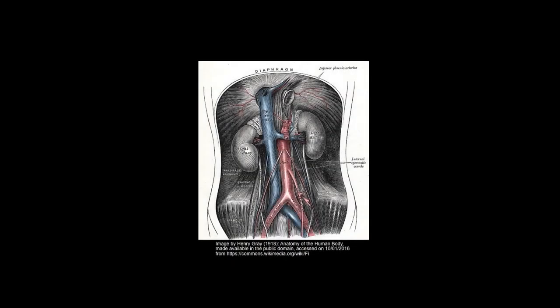This is a beautiful illustration of the IVC and aorta in the abdomen. You can see the IVC on the patient's right and the aorta on the patient's left. If you look closely, you can see the two branches off the anterior aorta superior to the left renal vein. These are the celiac trunk and the superior mesenteric artery. Follow the aorta inferiorly and visualize the iliac bifurcation.